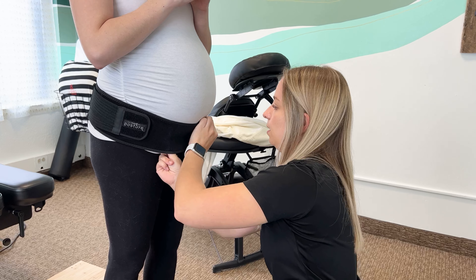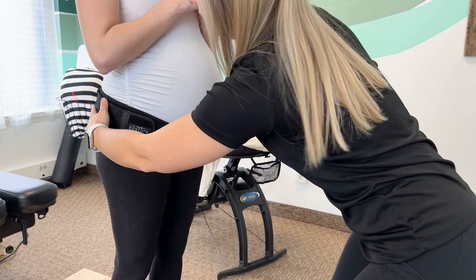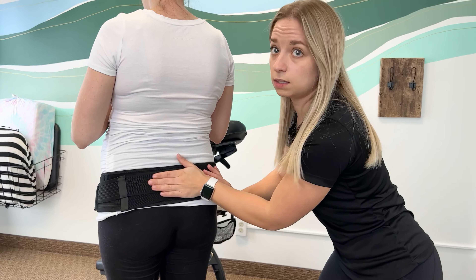So we're going to tighten it this way — this is step one. And see how low it is on the back? Can I have you spin around for me? You want this to cover right above where that tailbone is, right over that SI joint. This is what's going to give that stability.